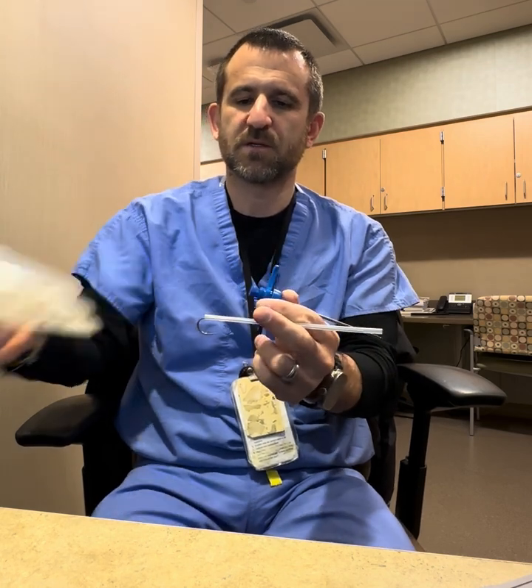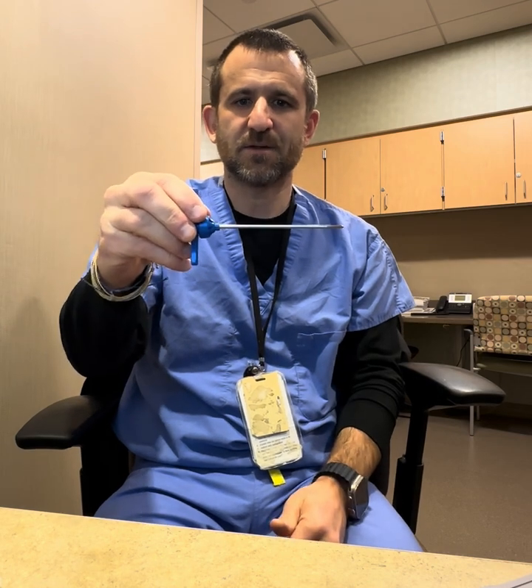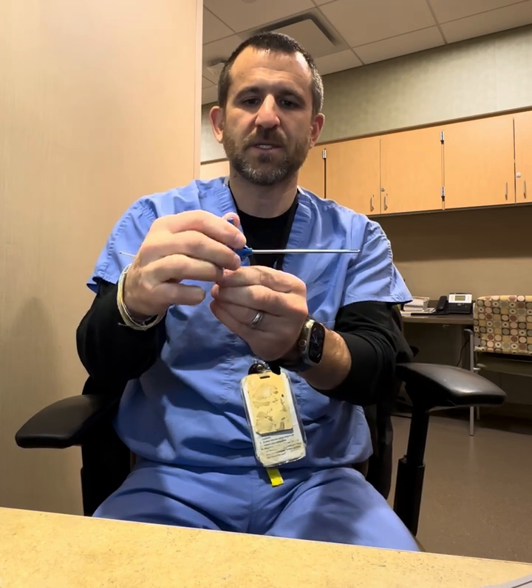What we're going to be doing first is use the Jamshidi needle with the stylus down the center, which has a very sharp tip that will help you to penetrate hard outer cortical bone. It comes with a T-handle, so we put our hand around the T-handle, rotate our wrist, and introduce this device into the bone.